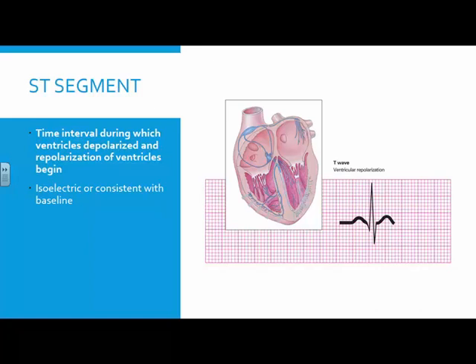Sometimes even the physicians are like, what in the world? And sometimes we see stuff on a monitor that we think is a big deal, and it's just something this patient lives with, and it's just the way that their heart works.